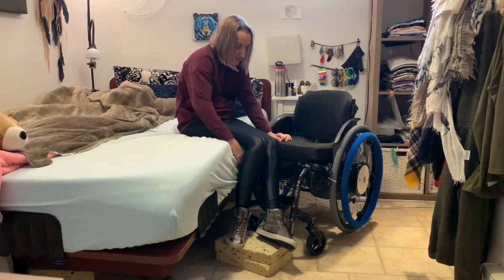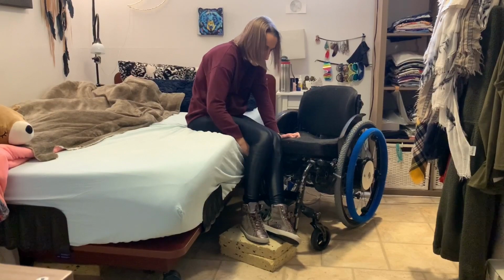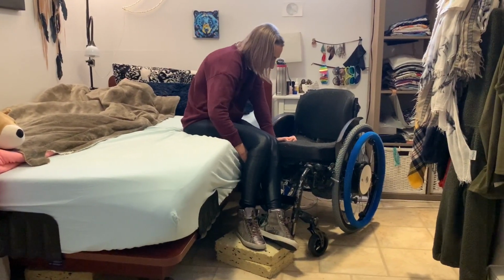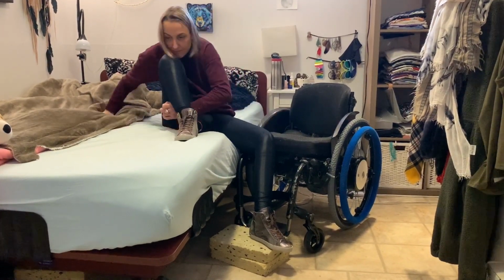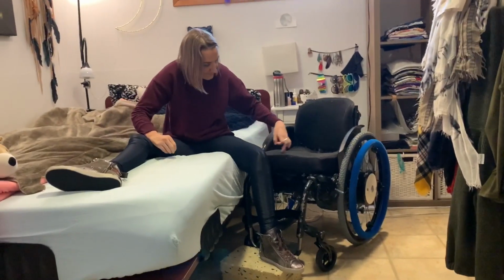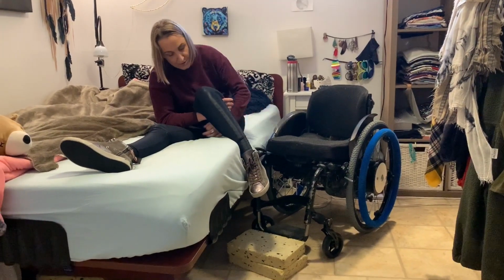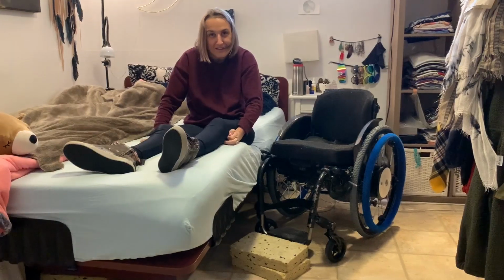For people that don't have triceps, I don't know how you would do this. But the board might be a better solution for you. So then again, I'll set my left hand on my chair, and then use my right hand to put my legs up onto the bed. Again, put my elbow on the leg that's already on the bed. So straighten my leg out. And ta-da! That's how you do a transfer.